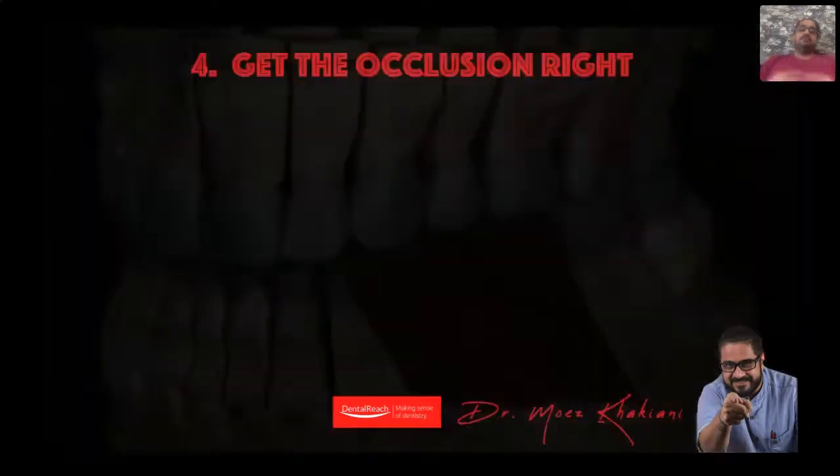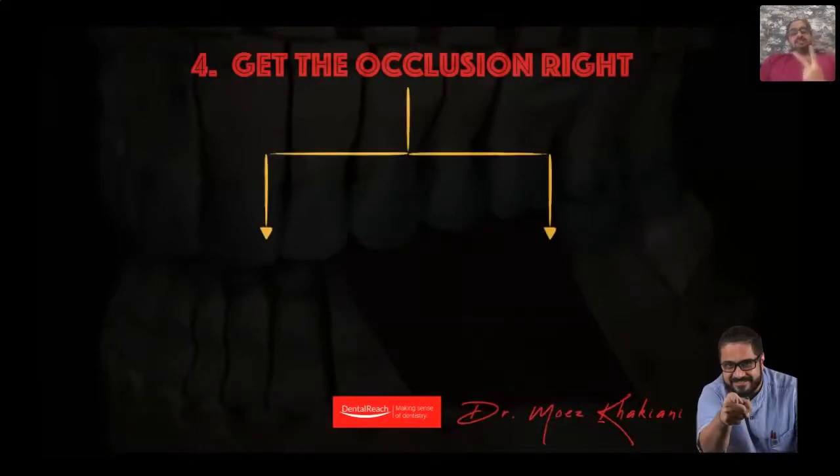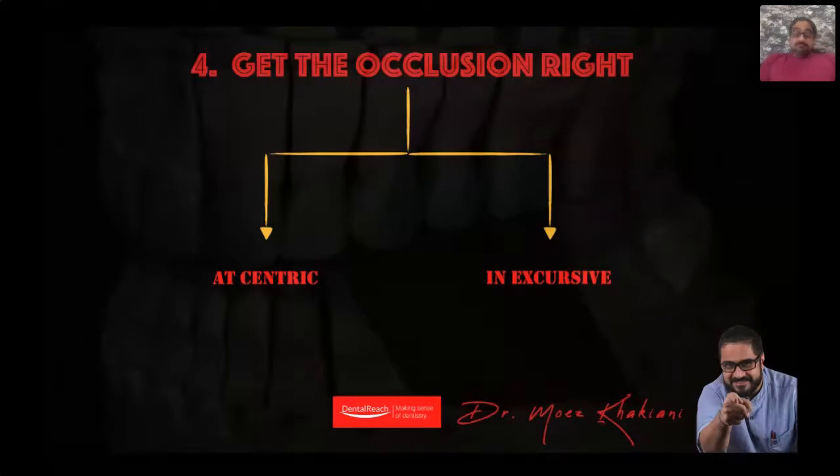The fourth one, of course, is get your occlusion correct. Here, very important, please concentrate on two aspects. First is static occlusion, which is in centric. Second is dynamic occlusion, which is in excursion. And for this, I strongly urge you to use a thin articulating paper. Anywhere going from an 8 micron up to 40 microns. 8 microns up to 40 microns.